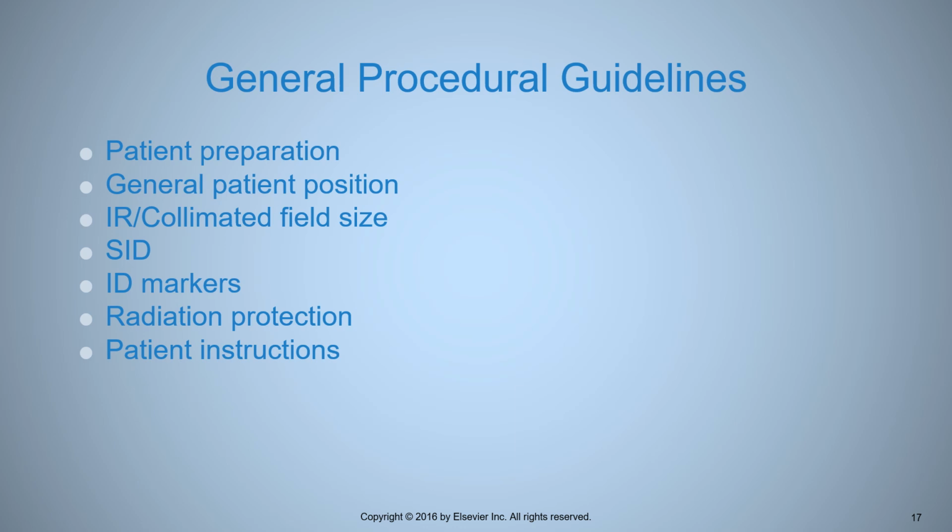All right. So that's basically the end of the anatomy. So going into preparing for exam, patient preparation, position, I already told you supine on the exam table typically. In the case of trauma, you're going to leave them on the stretcher or the gurney or whatever it is when they're in the ED, because I assume patient got a broken hip, that's where they need to go, is the emergency room. Okay, it is emergent.